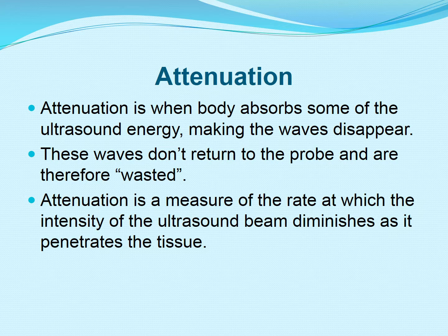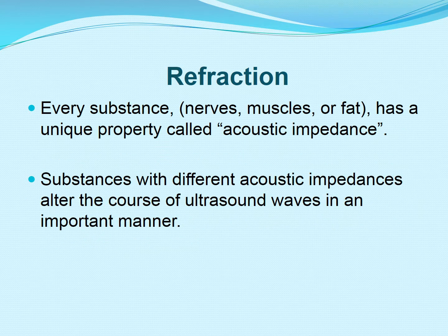Attenuation is the measure of the rate at which the intensity of the ultrasound beam diminishes as it penetrates the tissues. Attenuation always increases with depth. The higher the frequency of the ultrasound, the more rapidly it will attenuate.